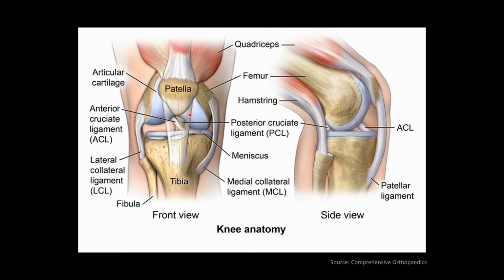However, what we can evaluate are the patella, the quadriceps tendon, the patellar tendon, the collateral ligaments, and a very limited view of the menisci anteriorly. And then posteriorly, we can see the popliteal fossa, which notably includes looking for things like Baker's cysts or popliteal cysts, and the vessels of the leg, including a DVT evaluation for the popliteal vein.